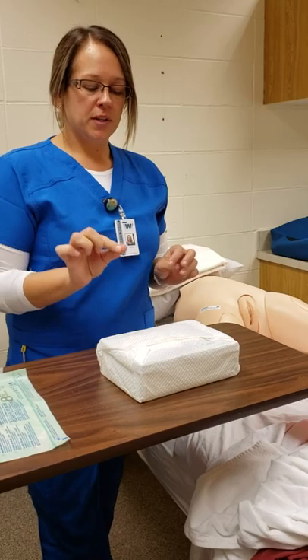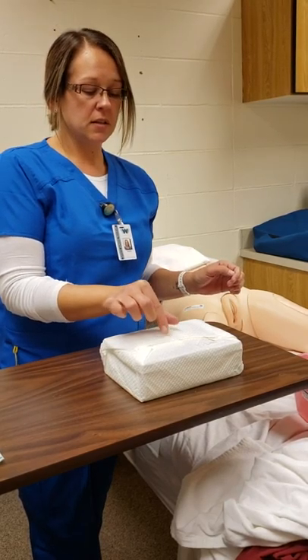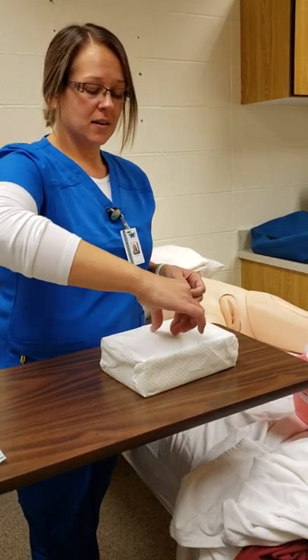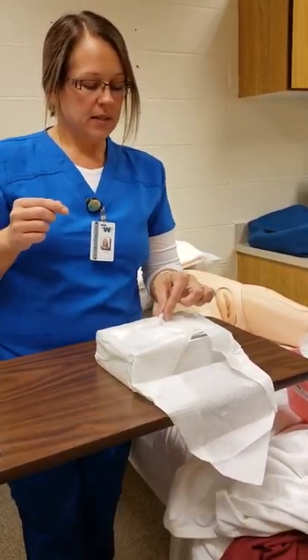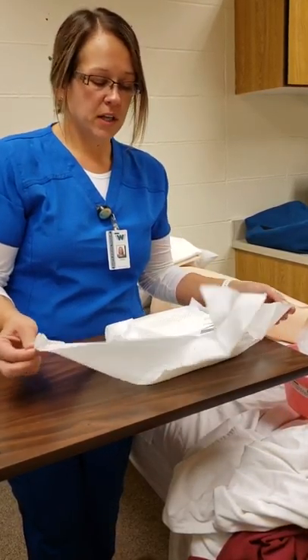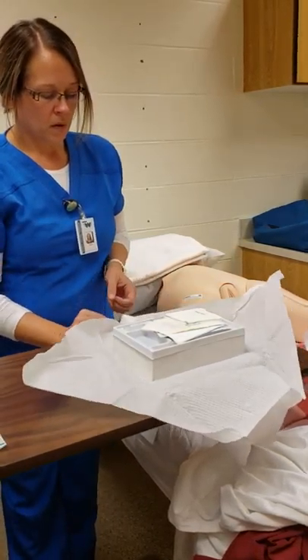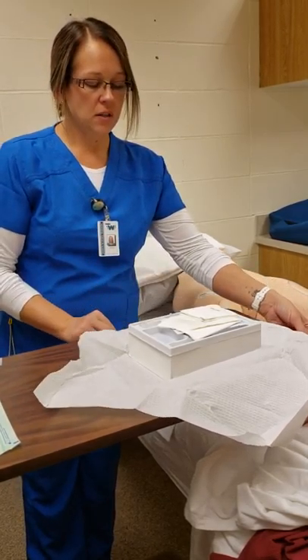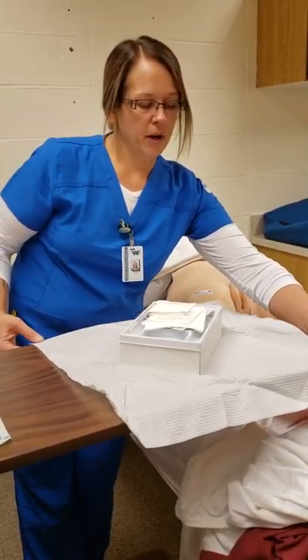I'm going to open the kit in the proper area so I have plenty of room. Opening the flaps away from me, making sure not to touch the edges — only the one-inch outer margin is acceptable to touch. I open each side carefully: far flap, left side, right side, near side — all touching only the one-inch outer margin and making sure not to cross my sterile field with my arms. Then I turn this into more of a square for a better working area.